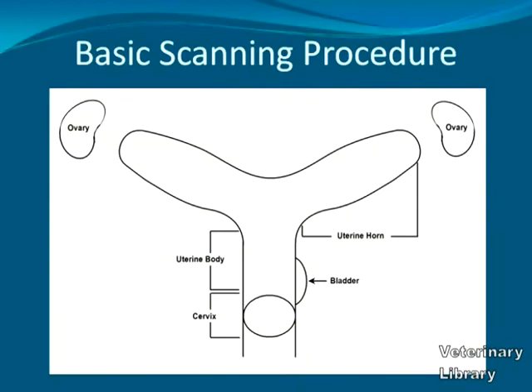Our next topic is the basic scanning procedure. Although relatively easy to explain, it will take a number of hours scanning a number of mares to develop proficiency. This first diagram is an aerial view of the reproductive tract. The rectum lies over the top of the reproductive tract.